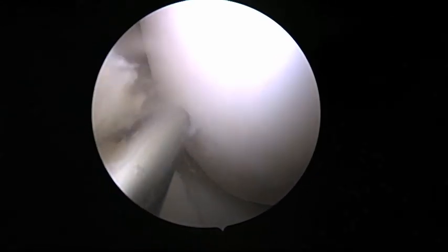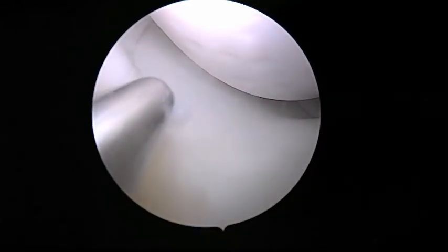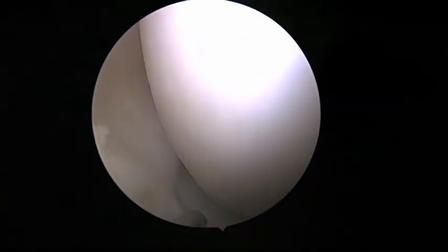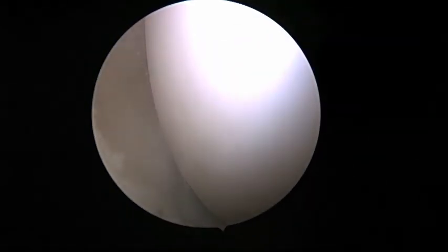The trocar is used to palpate the surface cartilage overlying the osteochondral defect as it corresponds to the area depicted on the MRI.